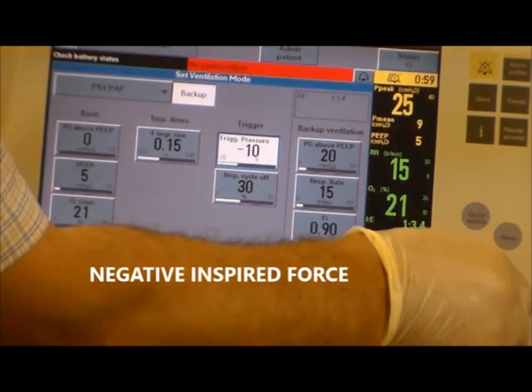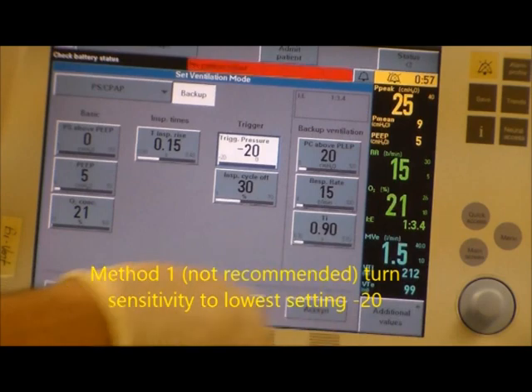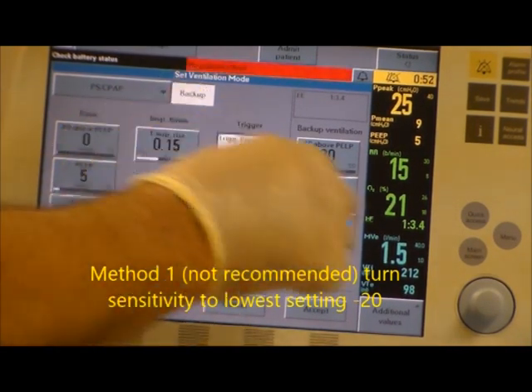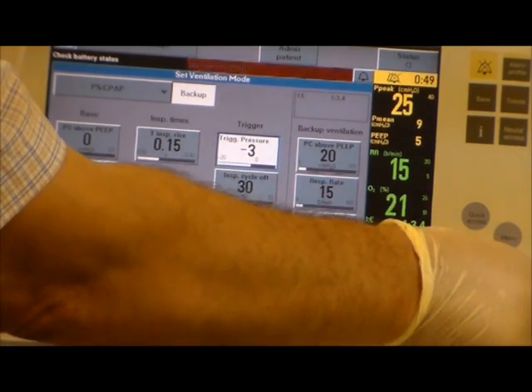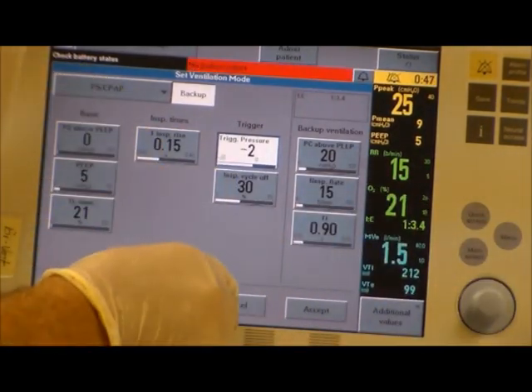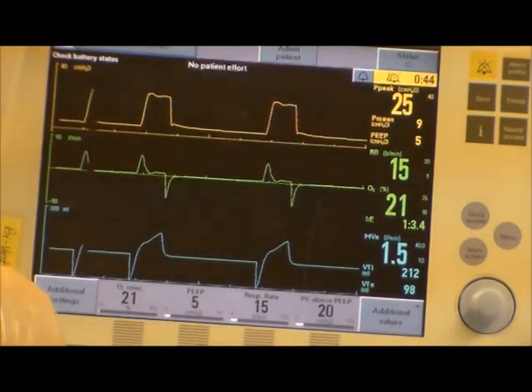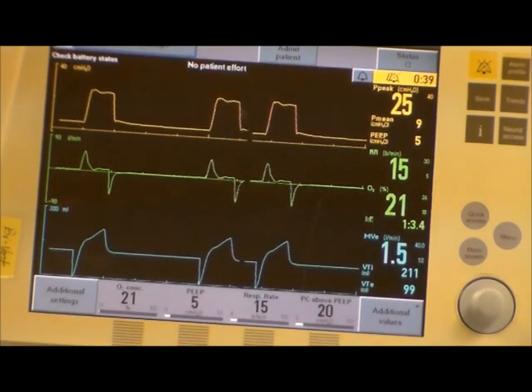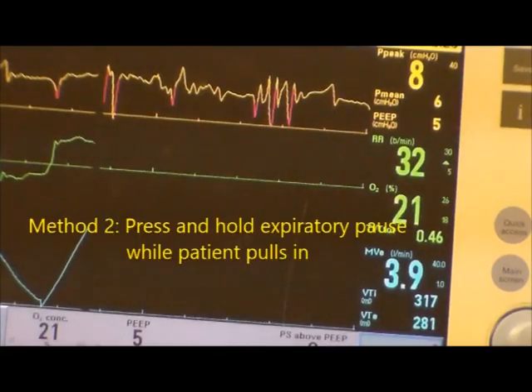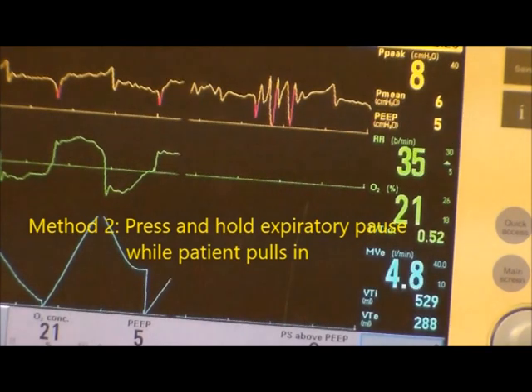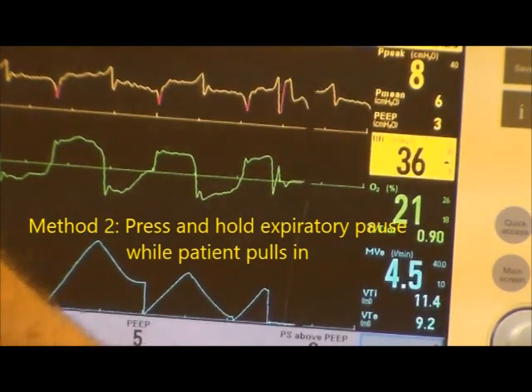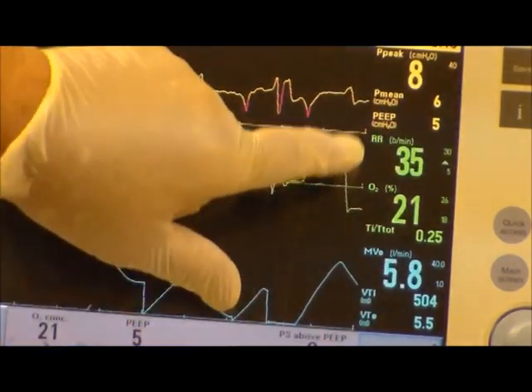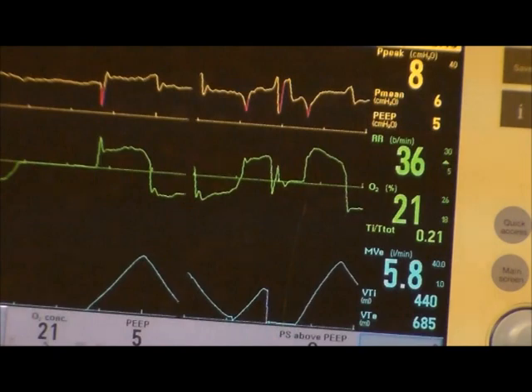There are two ways to get your NIF. The first way is to go in and set your trigger to negative 20 for pressure, then make sure you hit accept. We're also going through the other way, because you don't want to forget to return it back to normal settings. The second way is to actually instruct the patient on what you want them to do. To instruct the patient on the NIF, you're going to hold the expiratory hold in and tell your patient to suck in as hard as they can. Meanwhile, you're going to watch the pressure at the measured PEEP to see the greatest negative number you can get.